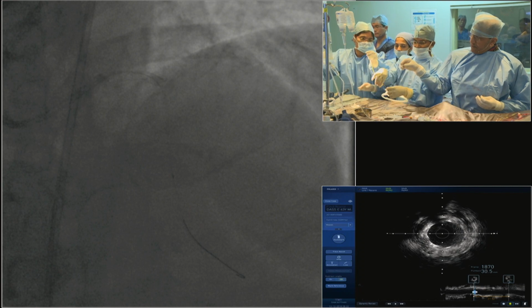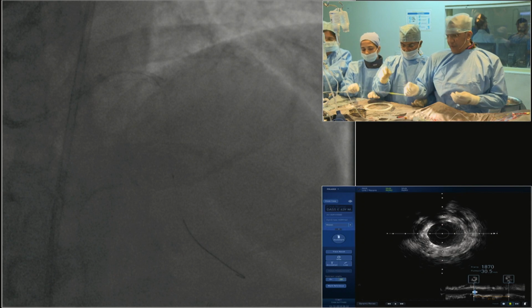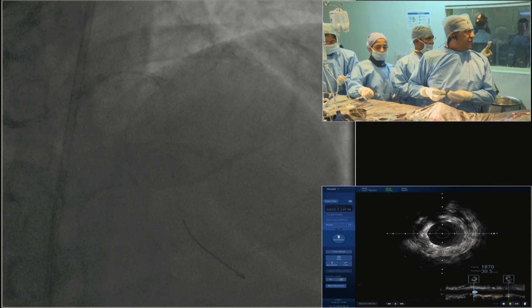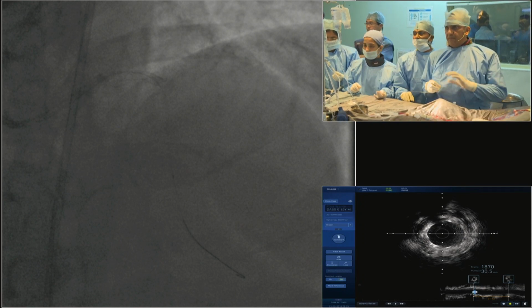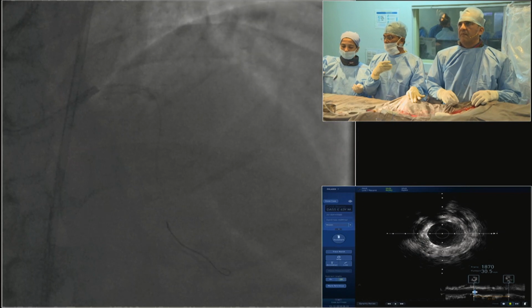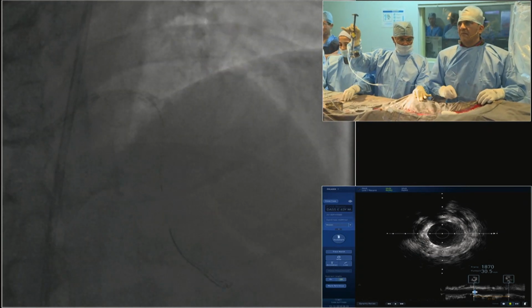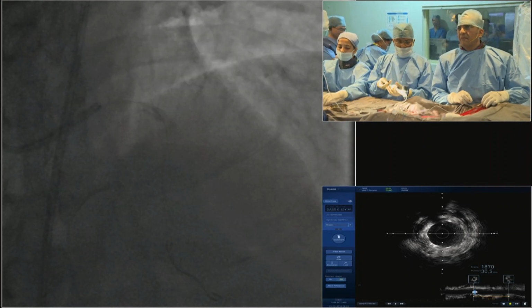Luckily, most of the present generation of stents have similar radial strength. We're not looking at great differences, at least in terms of long-term outcomes, which haven't been demonstrated for some of the newer generation of stents, and we are extrapolating the results of some of the gold standard stents. So I think it's a big area of discussion. In general, use the stent you're most used to, but prepare the lesion well. I think that is the most important dogma, rather than just deciding on the stent.